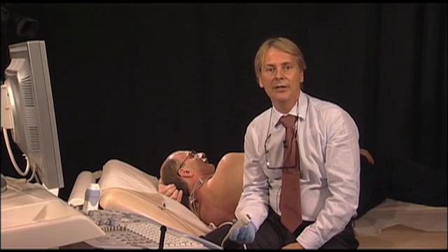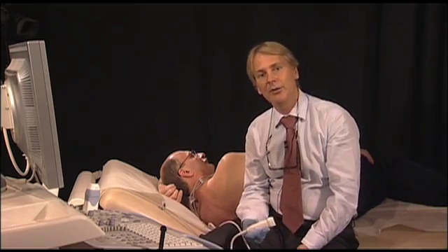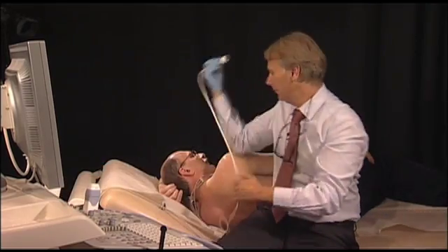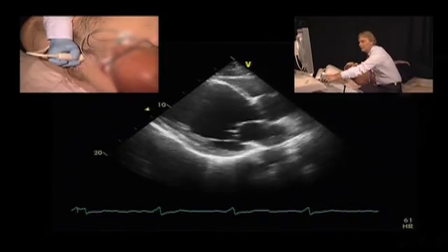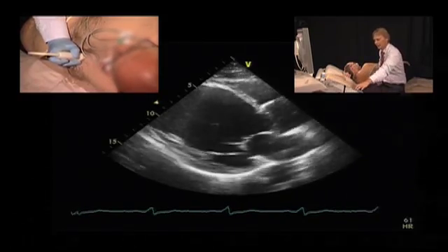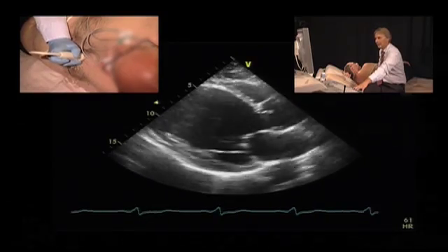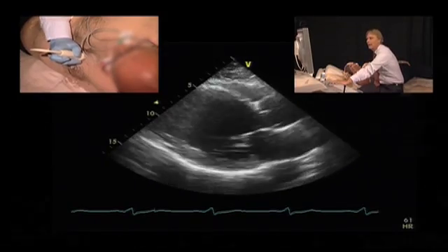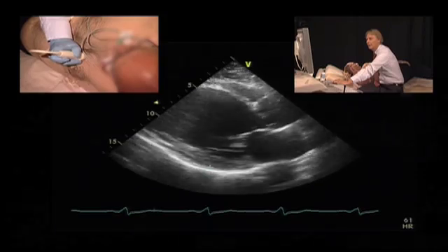Let's see how we can assess the patient with either ischemic or dilated cardiomyopathy. I'll start with the parasternal long axis view. As you can clearly see, the patient has significantly reduced left ventricular function. We have akinesis of the septum and residual contractile function of the posterolateral region.